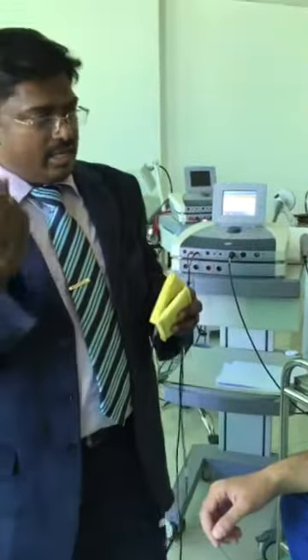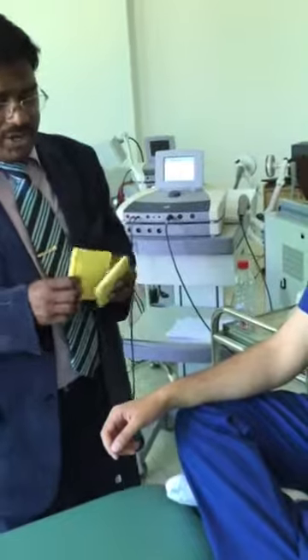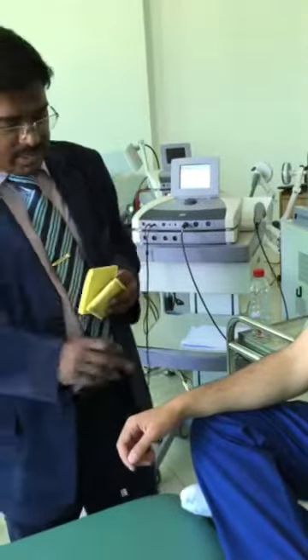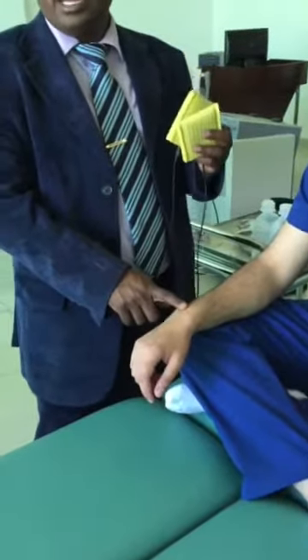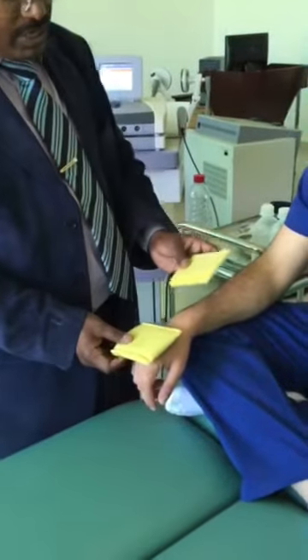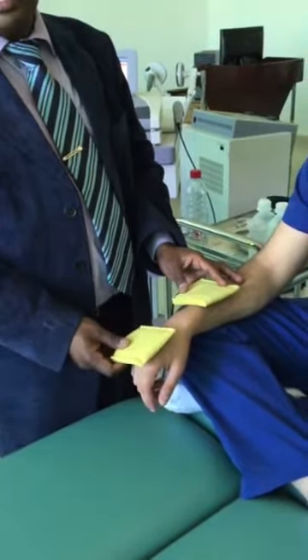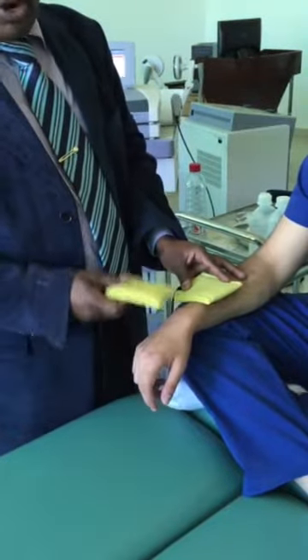The second is acupuncture-type application, used for chronic pain — if the pain has been there for many months, like three, four, or five months. In that case, you keep the electrodes one above and one below the pain. For chronic pain, you keep one electrode below and one electrode above, with the cathode above. This placement is used for chronic pains.